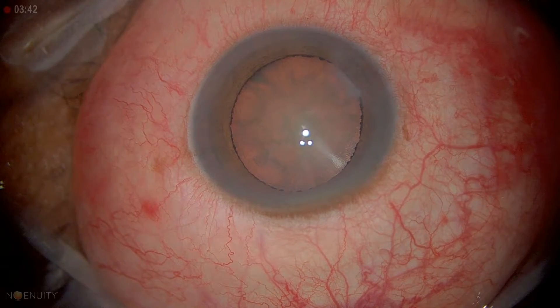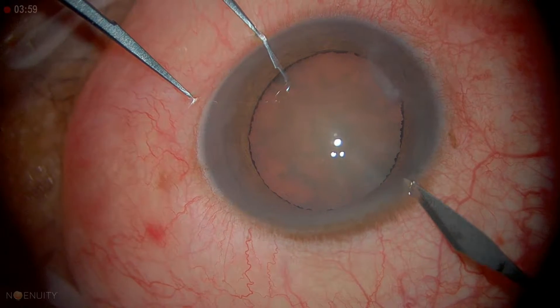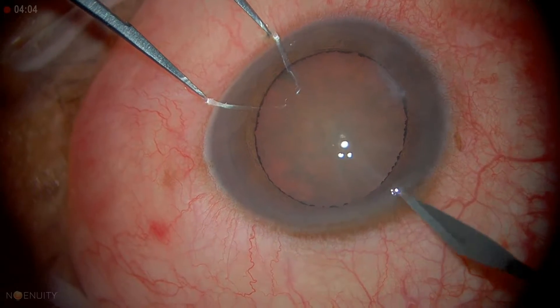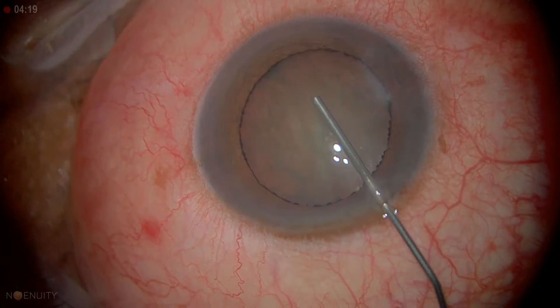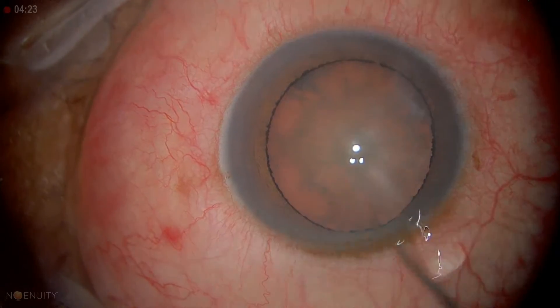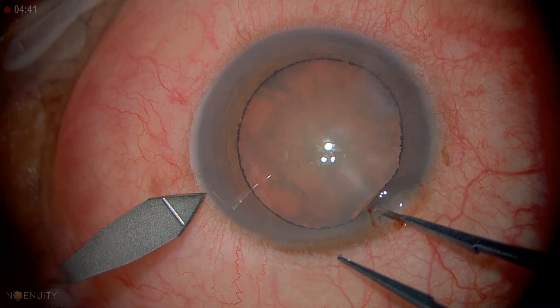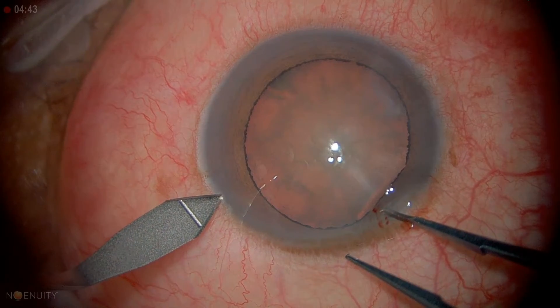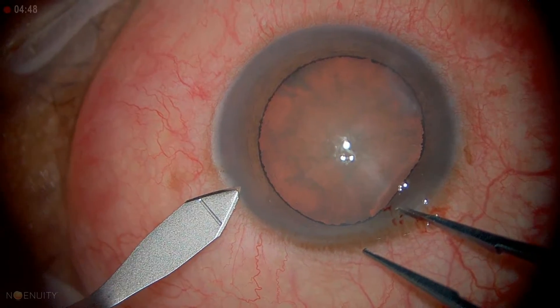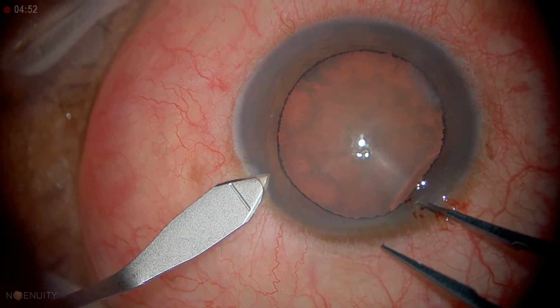We'll be doing a clear corneal incision for this. I like to keep the forceps open to stabilize the globe. We're going to go ahead and put in some viscoelastic, deepen the chamber, and use the keratome to stabilize the globe with our paracentesis. Enter a little vertically, then flatten it out, moving forward and wiggling a little bit for maximum control.